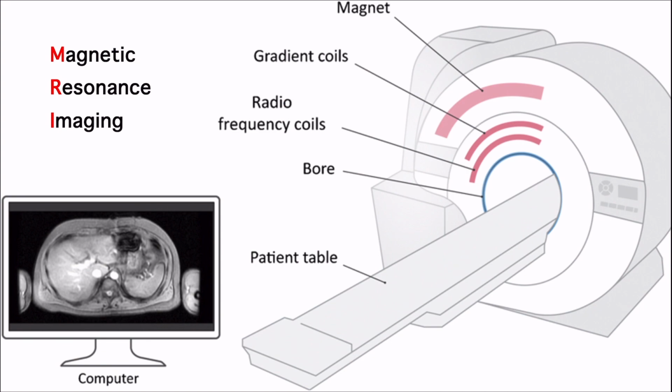and this can be put into an image, as you can see here on the left-hand side on the computer. This image can be used to differentiate different tissues, which can lead to noticing abnormalities, or for example also potential tumor growth.